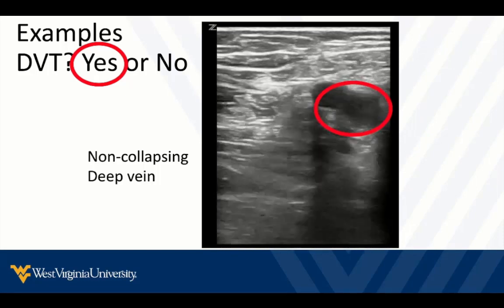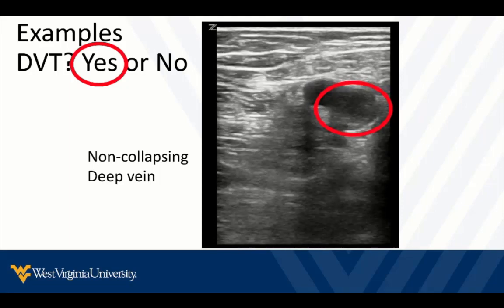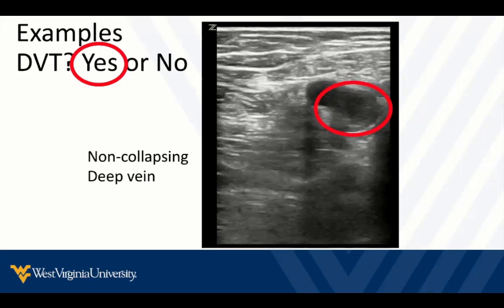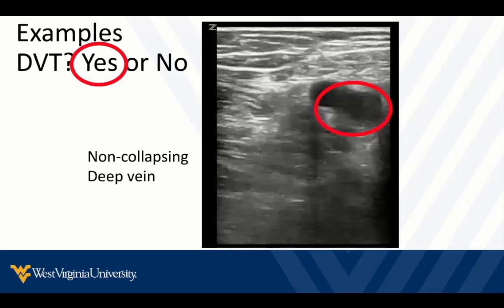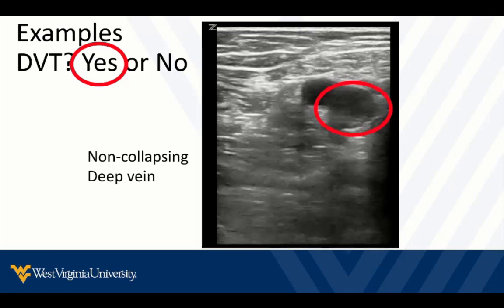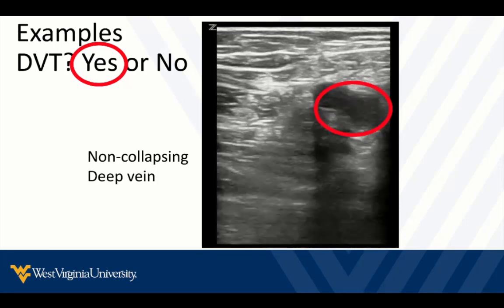they go. Sometimes a question I get is, does pressing on the vein lead to embolic events? Not that I know of that's ever been reported. Obviously, if you see a clot, don't sit there and massage it a whole bunch. Do enough to make the diagnosis. It's okay to let learners look for a few scans, but don't let them spend 20 minutes on there massaging it up towards their heart and their pulmonary arteries.